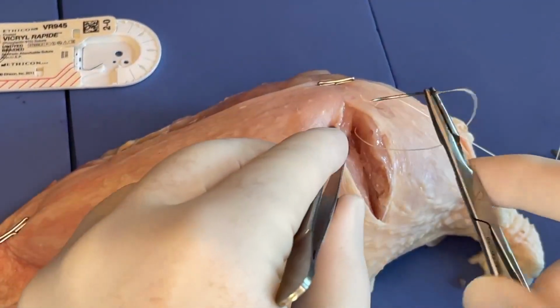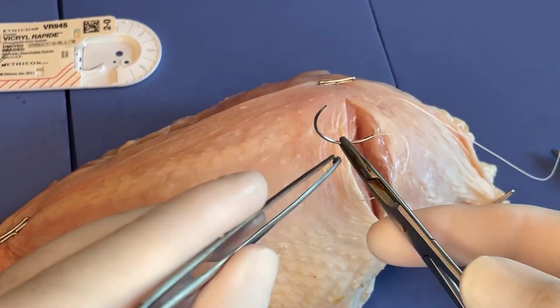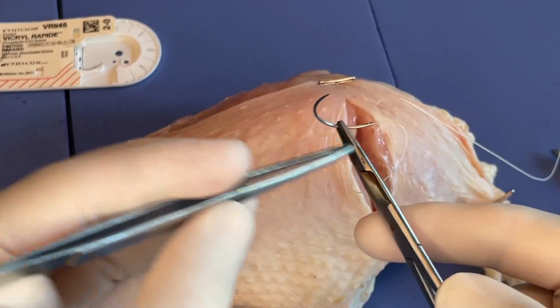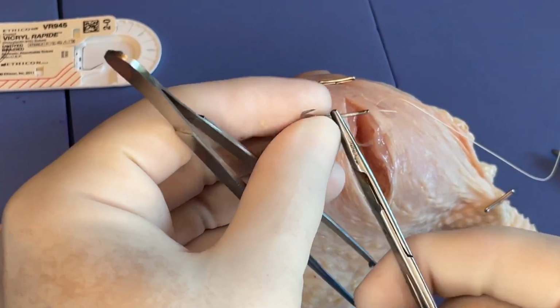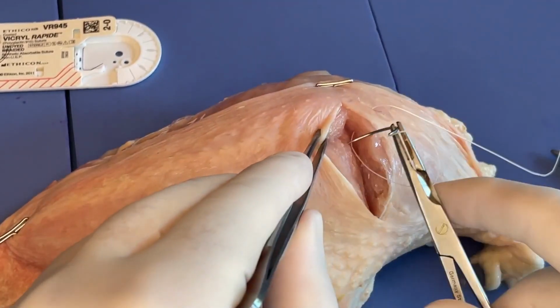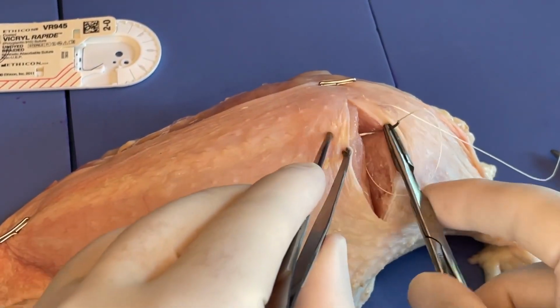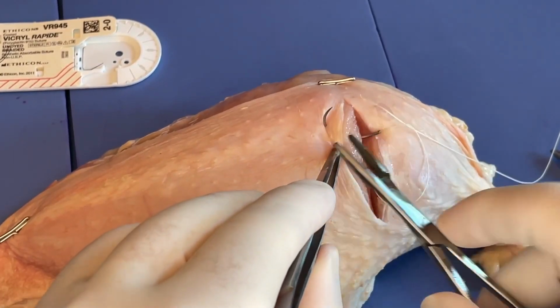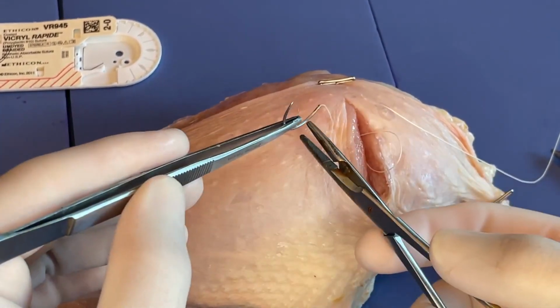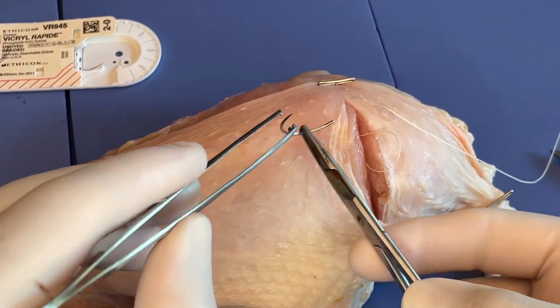So first bite through there, we've got the needle reloaded about 3/4 of the way back from the tip towards the swedged end, and I've got just a little bit of an angle there. So you're going to grab that tissue, kind of open it up, go in, curvature of the wrist to pop out, grab the needle, pull it through to forceps, reload the tissue.